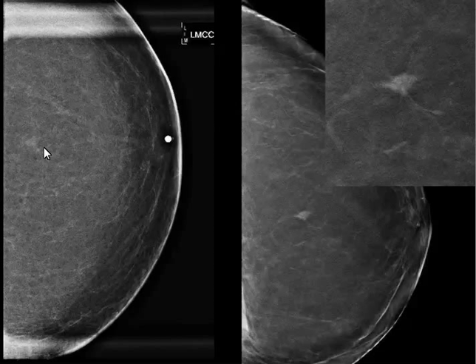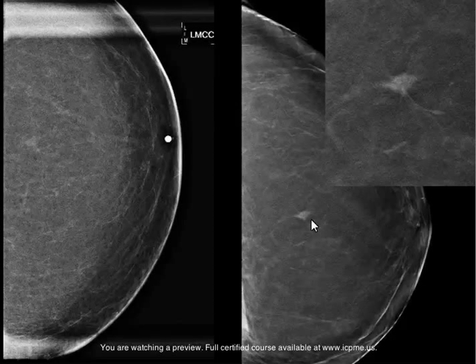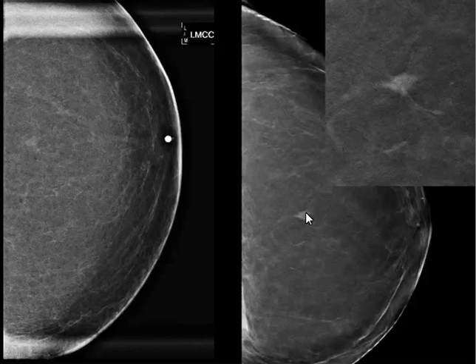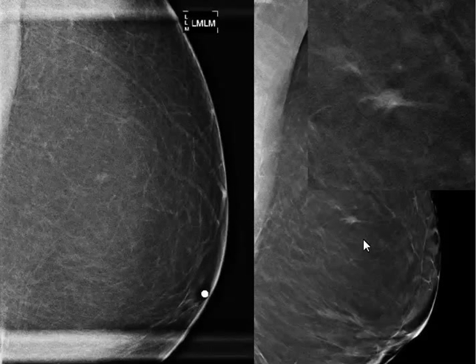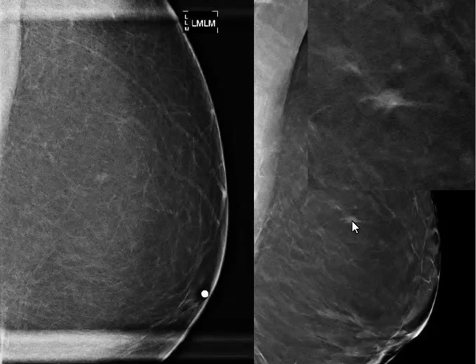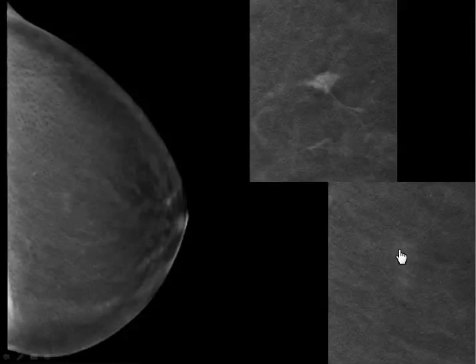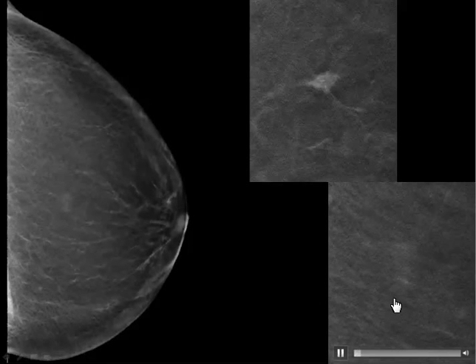That's why I've told my colleagues in the past: don't let the spot view talk you out of a great call. But on tomo, you don't have to worry about that — look at it on tomo. You can see it's a focally dense mass with irregular margins, and you can appreciate that quite easily. This is the lateral tomo that was done, and we can see clearly that this is a spiculated mass.